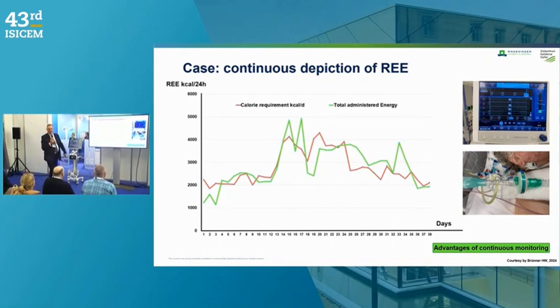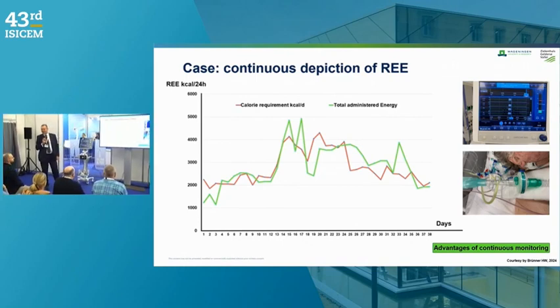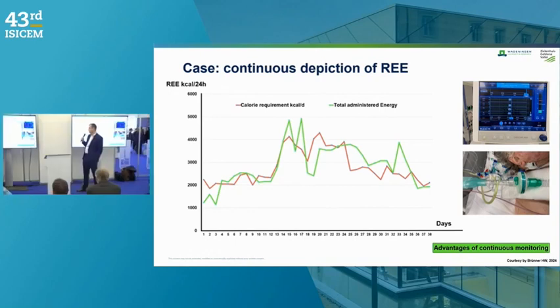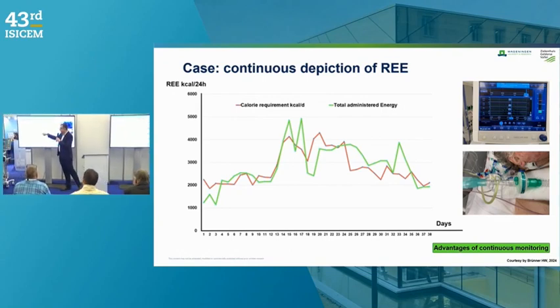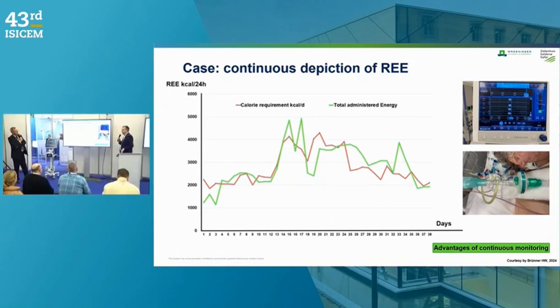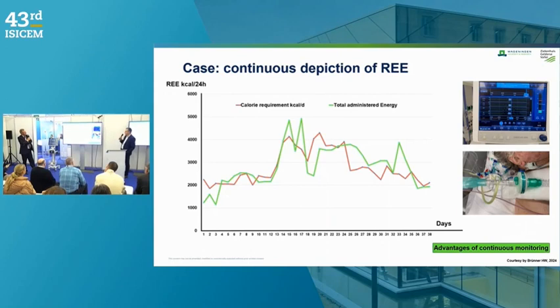Why should it be higher here maybe? Any idea? Exercising could be. Was the patient already exercising here, Horst? Yes, but he had several surgeries during this time, and I think he was in a septic situation at this time. And you see at the end of the period, here was a steady state. And we have a great part of enteral nutrition. Until this point of time, we have only parenteral nutrition in this patient.